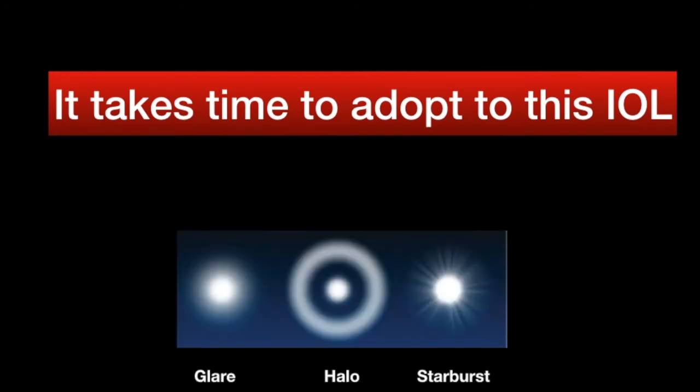To explain this further, immediately after surgery, patients may notice glare, halos or starbursts around the source of light at night time. This may make night driving, especially highway driving, difficult. However, with time, the effect of the symptoms reduces.